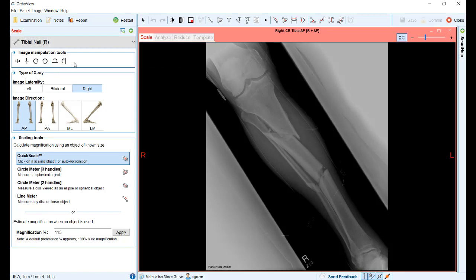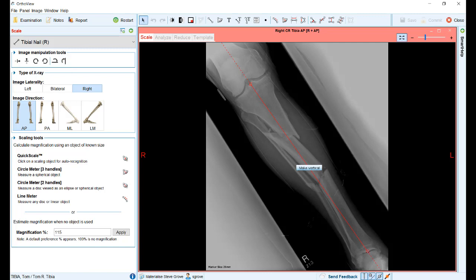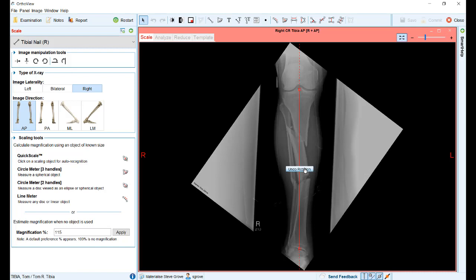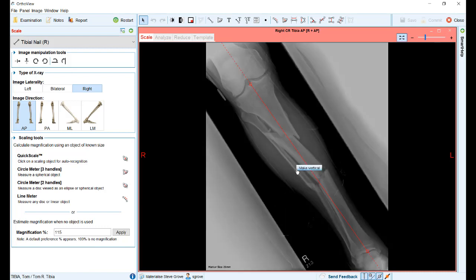For example, in this situation we can choose the vertical placement option, draw a line down the tibial shaft, and then click on the make vertical button to rotate the image to correct the orientation. If desired, the rotation can be undone using the undo rotation button. You can then manipulate the points to correct the orientation and try again.